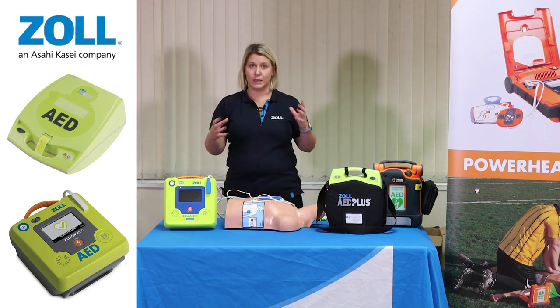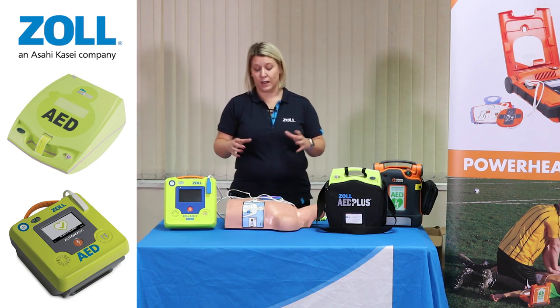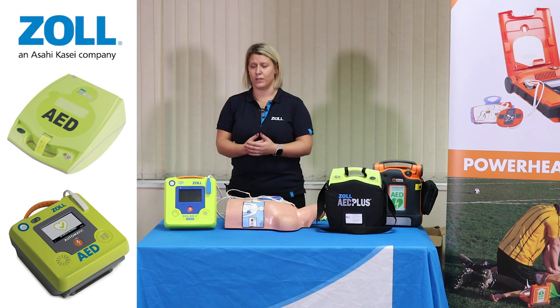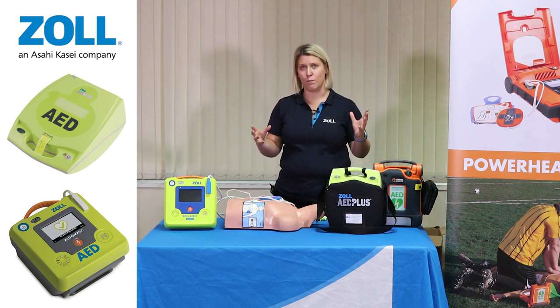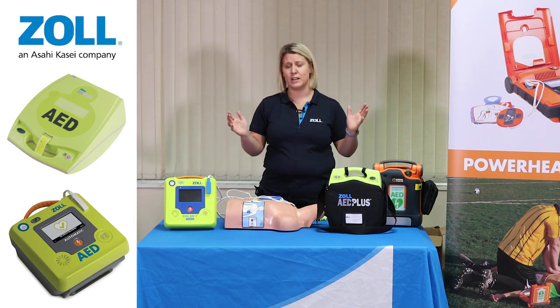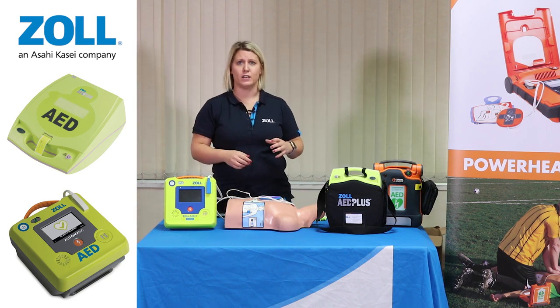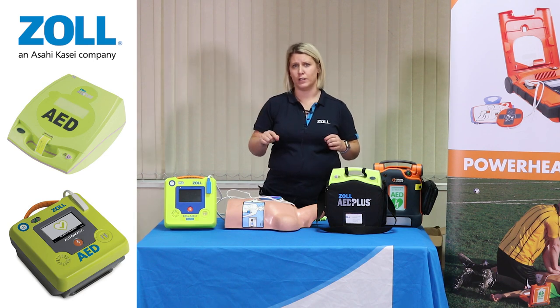We know from research done by the Resuscitation Council that using a defibrillator with high quality CPR increases chances of survival by between 50 to 75 percent. So this technology is groundbreaking and it can make all the difference for someone who is not trained in how to respond to this sort of situation. Whether you're at home or in the workplace and not first aid trained, this device will tell you exactly what to do from start to finish.